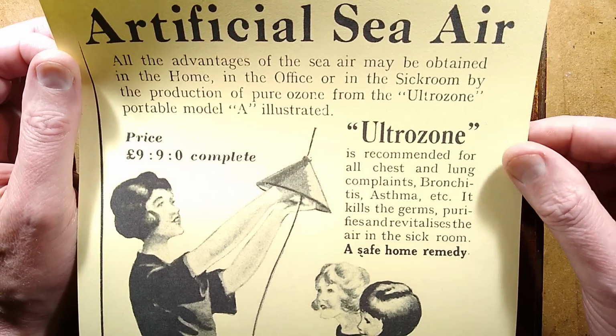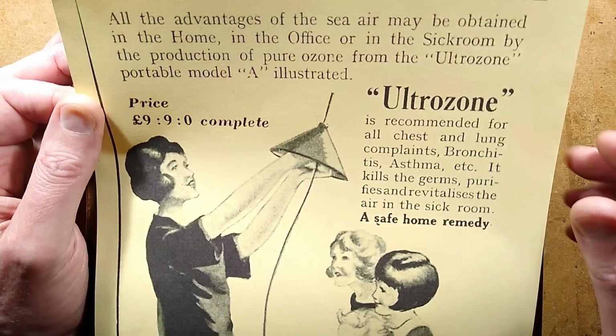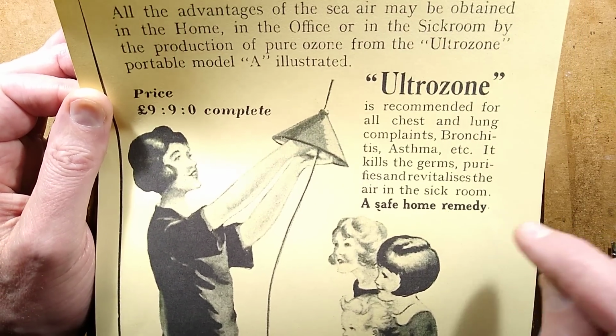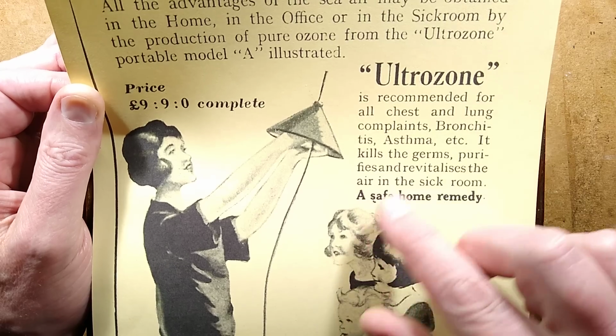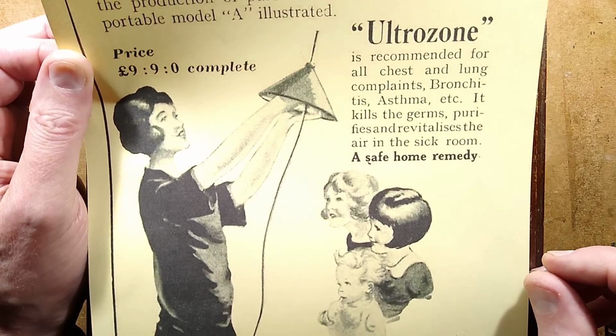Portable Model A illustrated. Price £9 9 shillings. That's about £500 in relative terms to the current era. Ultrazone is recommended for all chest and lung complaints, bronchitis, asthma, etc. It kills the germs, purifies and revitalises the air in the sick room, a safe home remedy.